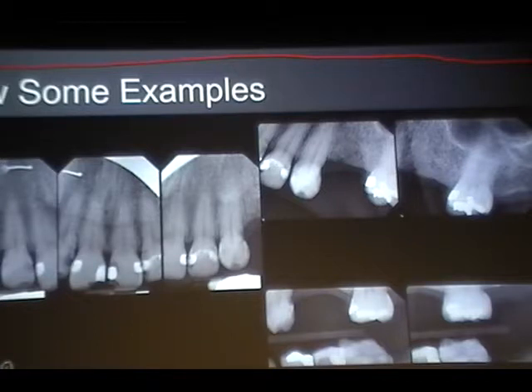What could have happened? Basically, the sensor has flipped like this, right? It's moved. It's not parallel to the occlusal plane. How about this one? They were balancing it on one too, so it was hard to get the actual image.